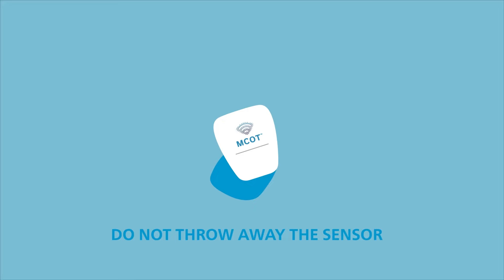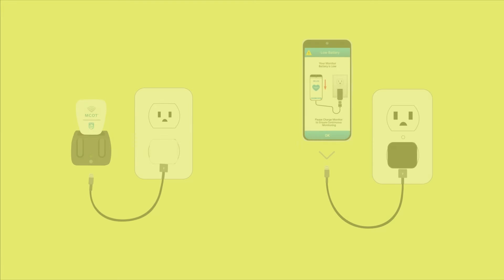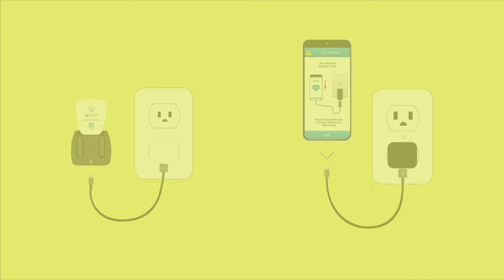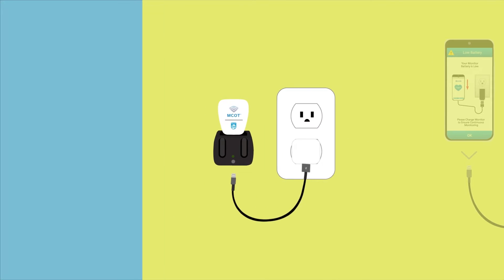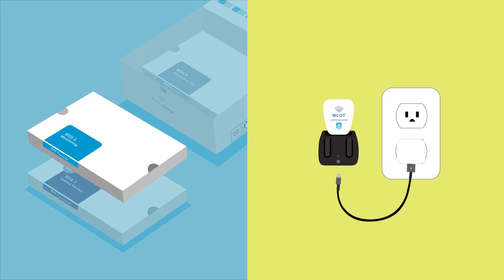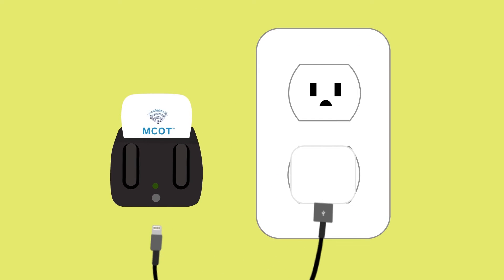You will reuse the sensor on a new patch after it is charged. Over the course of your monitoring service, both the sensor and the monitor will need to be charged. It is now time to charge the sensor. First, locate the sensor charging cable in box 2. Connect the sensor to the charging cable and plug it into an outlet as shown. Charging may take approximately 90 minutes and is complete when the sensor light turns solid green. Please ensure the sensor is completely charged before applying another patch.